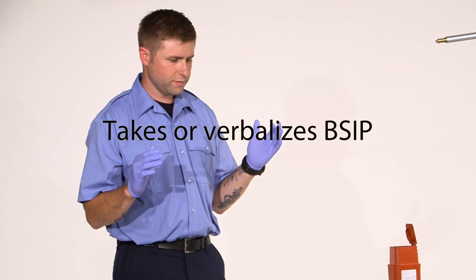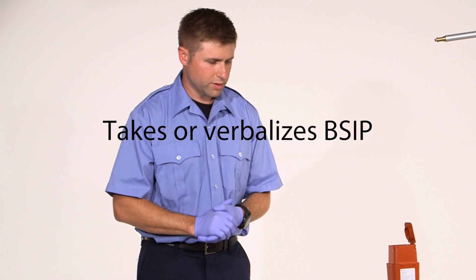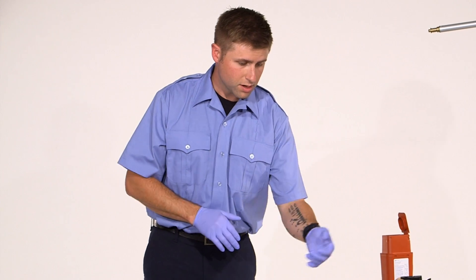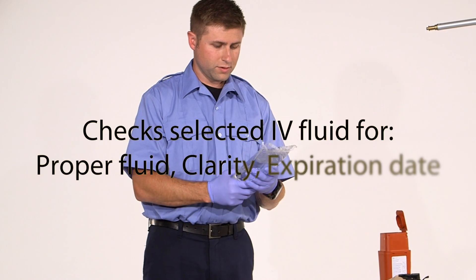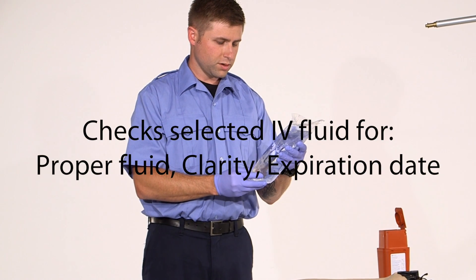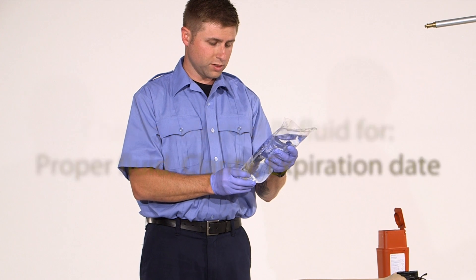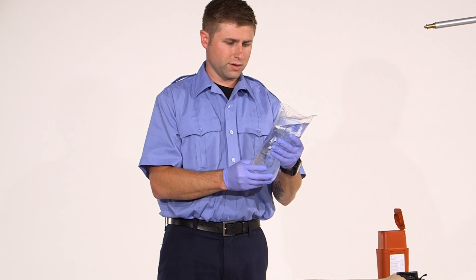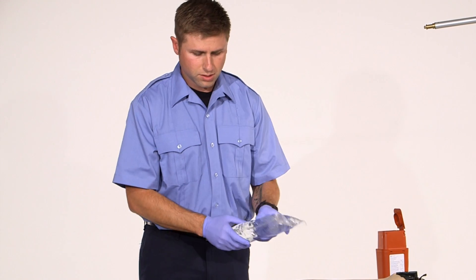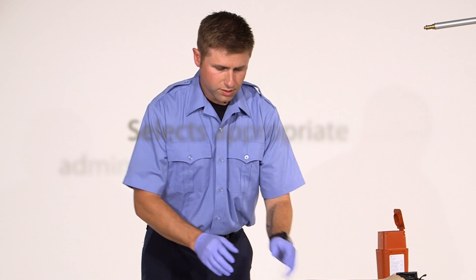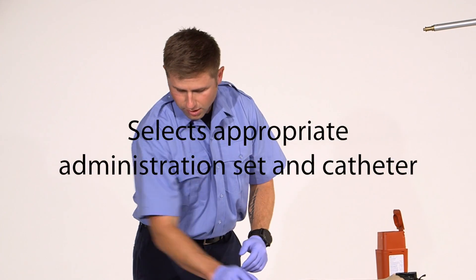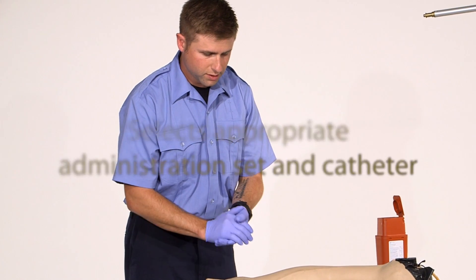BSI. My scene is safe. All right, I am going to place a catheter into this arm and check my fluid. First, I'm going to make sure I have the right fluid, that my expiration and my fluid's not expired, and the clarity of the fluid. Make sure it's nice and clear. I'm also going to make sure I've got my drip set and the correct catheter and all the supplies that I need.